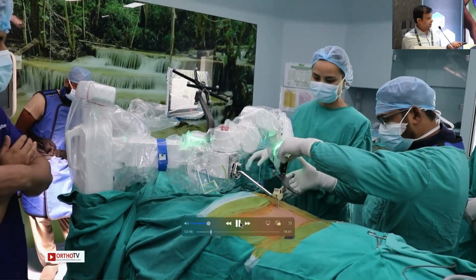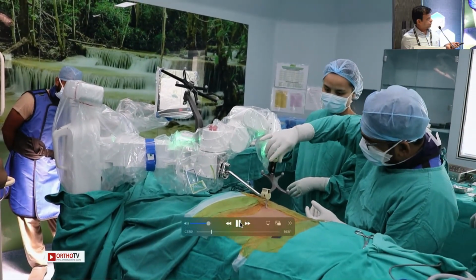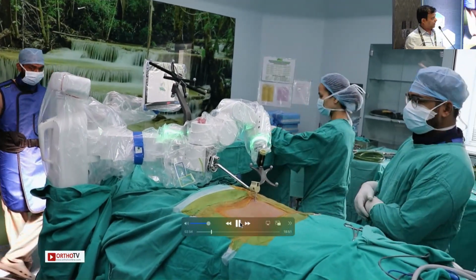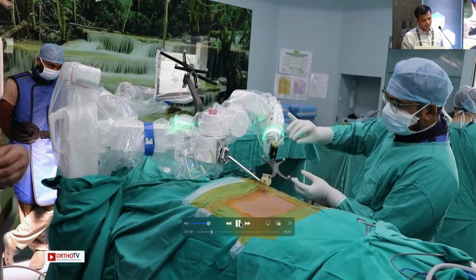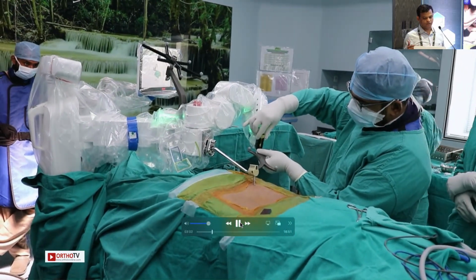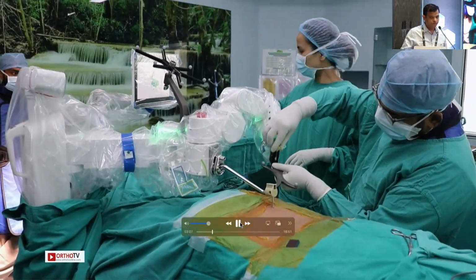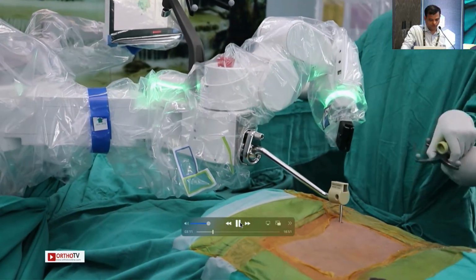Now we are again marrying the navigation to the robot. So you just fix the tracker and take a snapshot from the nav camera, and then the navigation is set up for the surgery. After this, now registering the patient, taking a 3D image through the O-arm. For that, you have a different kind of tracker which we are soon going to fix.